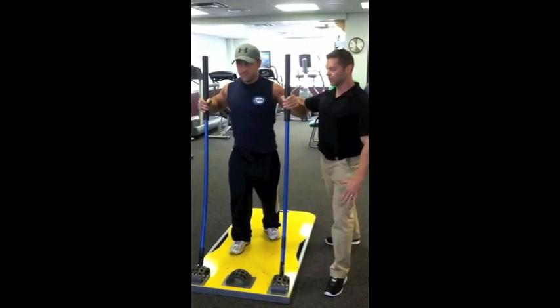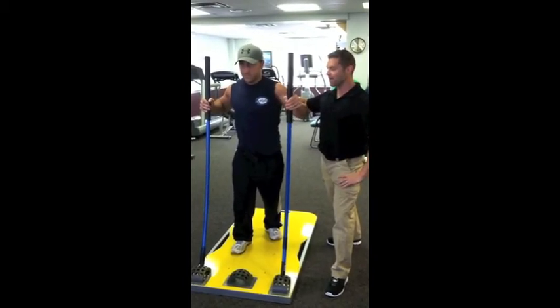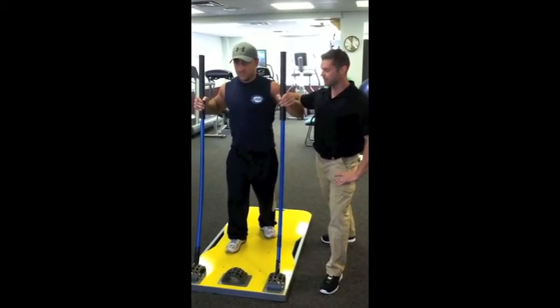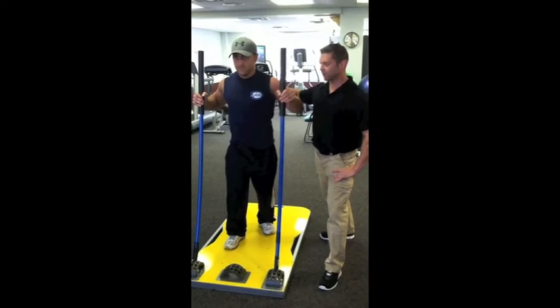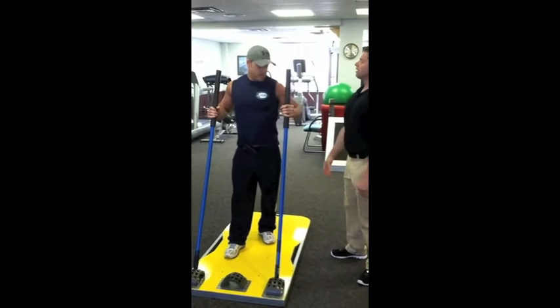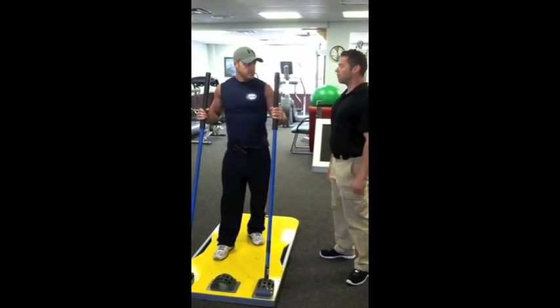Joe performs the first set of ten reps — one, two, three, four, five, six, seven, eight, nine, ten — and rest. Good. Joe, can you give an explanation of what you feel when you're pushing the rods, first compared to using a dumbbell or a barbell?